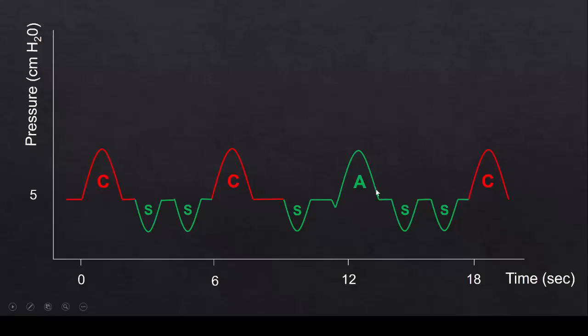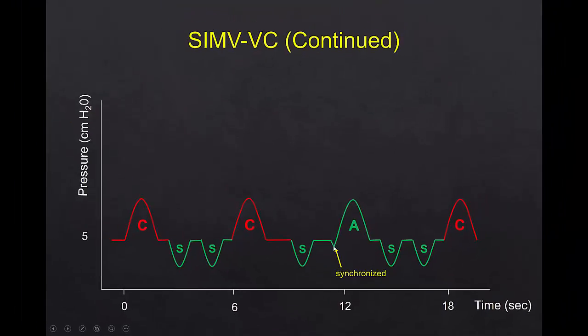It's a little bit more comfortable for the patient, but these breaths are not synchronized. They're spontaneous because they're quite in between the timer for the machine breaths. So here's a synchronization to a patient effort.